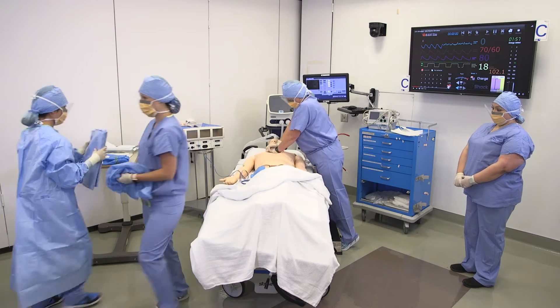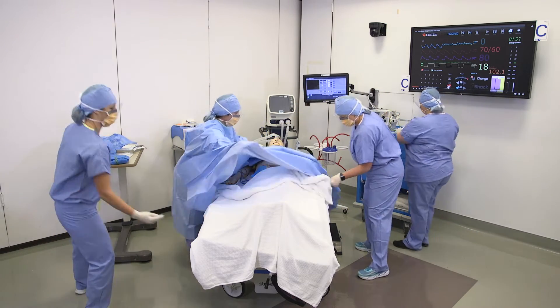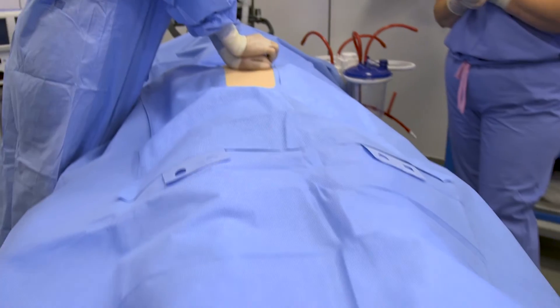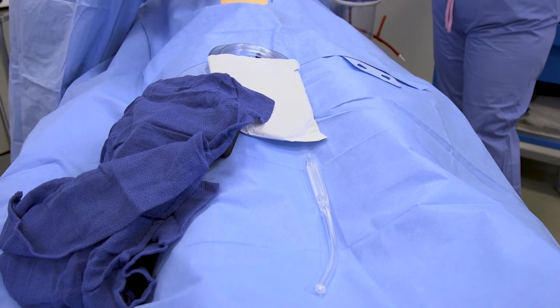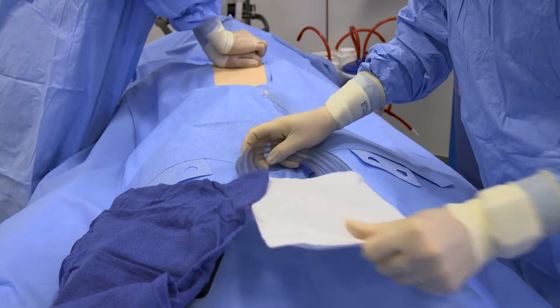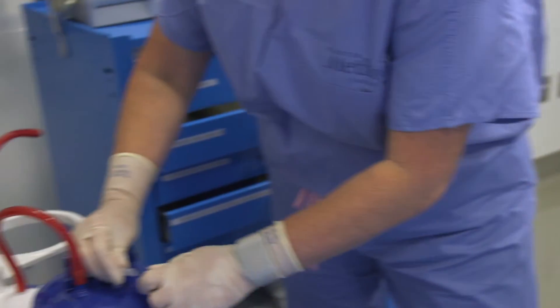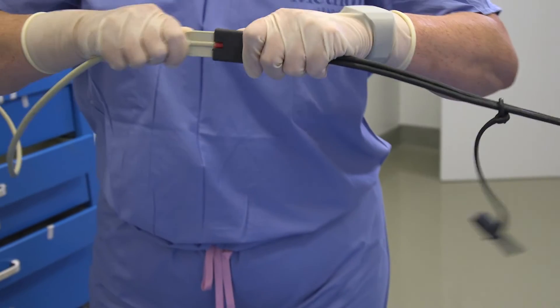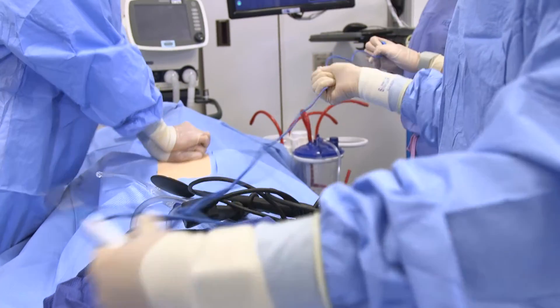A team member will hand the drape to a sterile person who will then drape it over the patient. Once the sterile field has been prepared, a team member will place sterile suction tubing, a yankauer, the internal defibrillator paddles, and bovie onto the sterile field. The sterile suction tubing should be attached to wall suction, the internal defibrillator paddles should be attached to the defibrillator, and the bovie should be plugged in at this time, careful to maintain sterility.